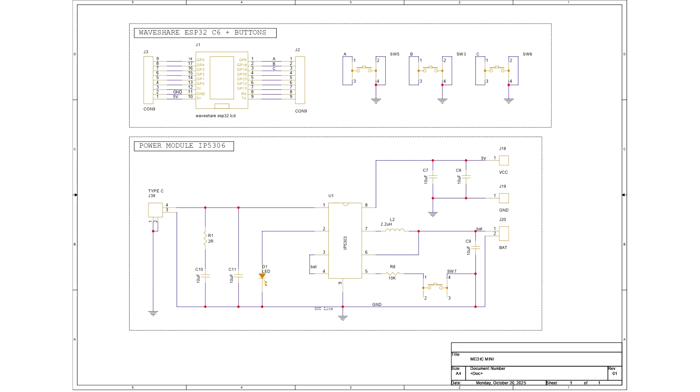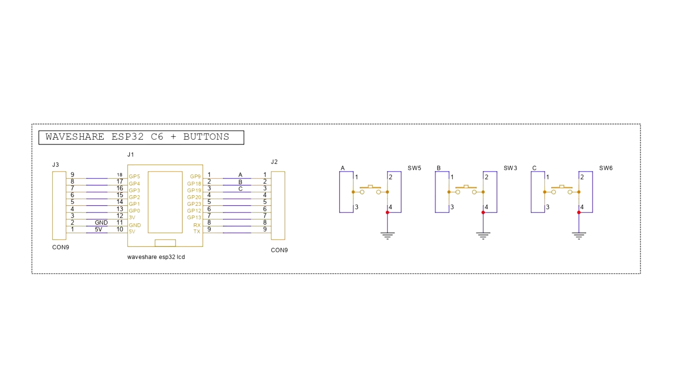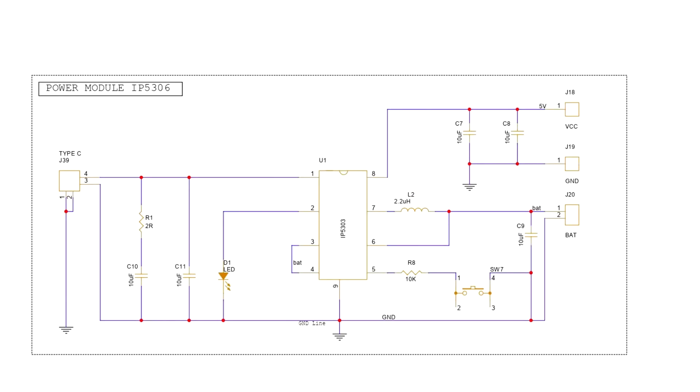Next comes the PCB design for the Medic Mini, which was split into two main sections. First, we have to build the schematic around the Waveshare ESP32-C6 Dev Kit module, which is connected to three tactile buttons for user input. These buttons are wired with GPIO 9, GPIO 18, and GPIO 19, with each switch also connected to ground. When a button is pressed, the corresponding GPIO pin is pulled low, registering a valid input.